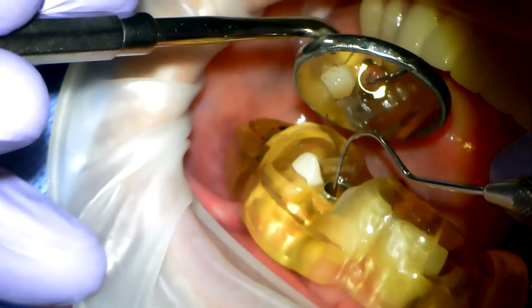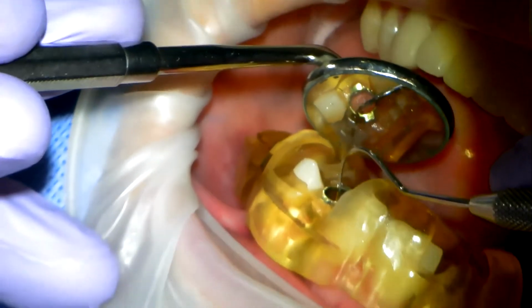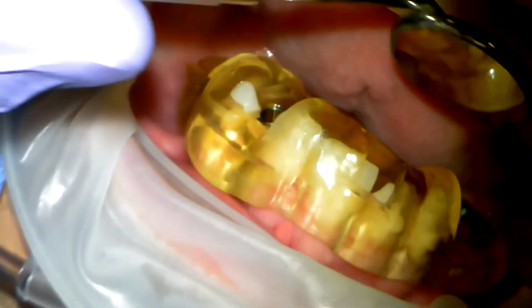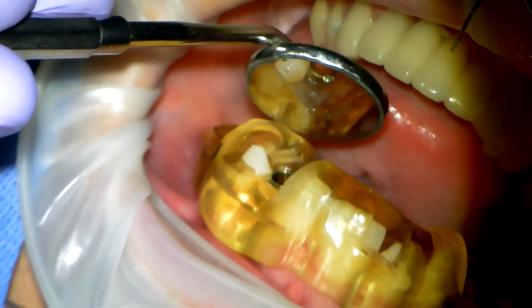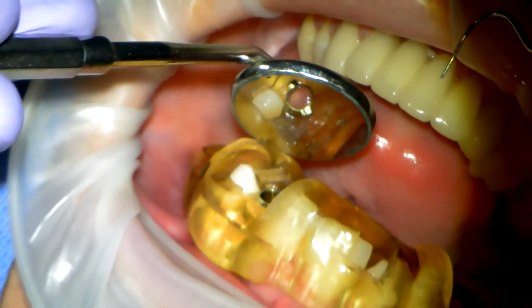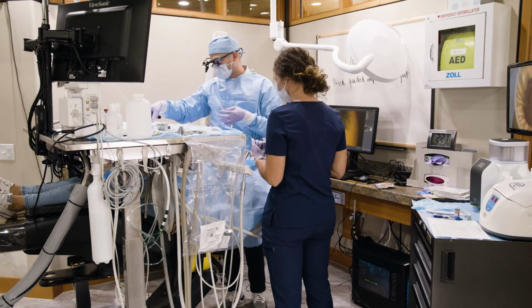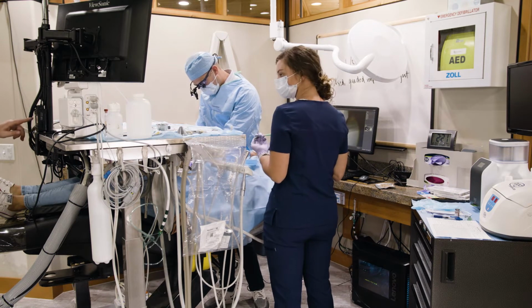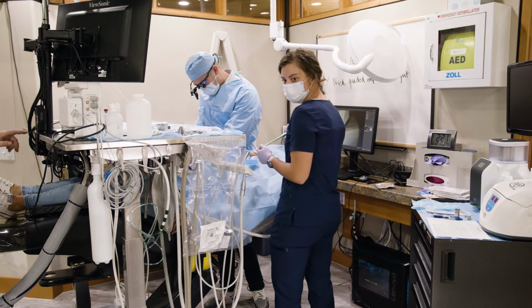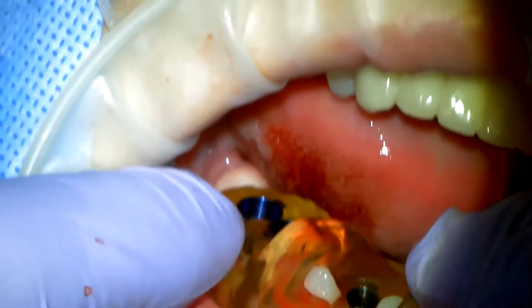The fact that I see a gold sleeve means that this is a narrow implant site. The other ones are blue, blue, and so here at gold is a narrow implant site. So I love that. That fits beautiful. Give you a little more medicine, okay? Okay, the guide is seated properly.